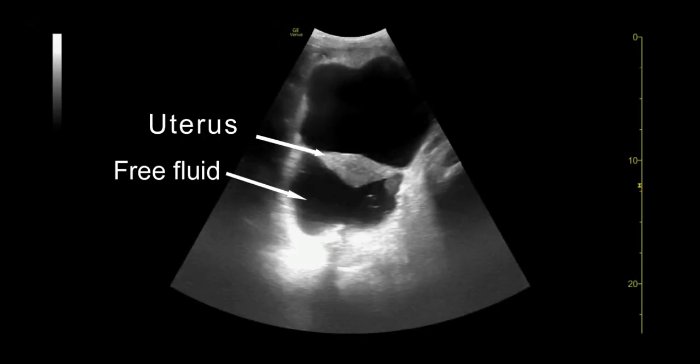In this image from a female patient, a large amount of free fluid can be seen posterior to the uterus, with the uterus seeming to float within the free fluid.